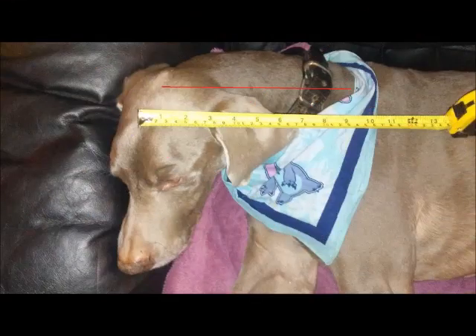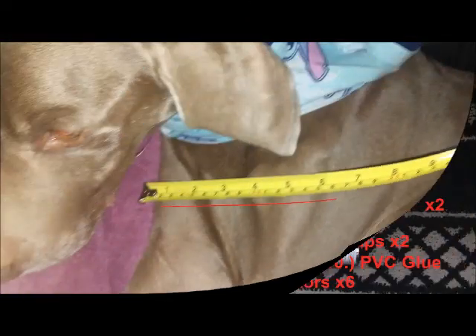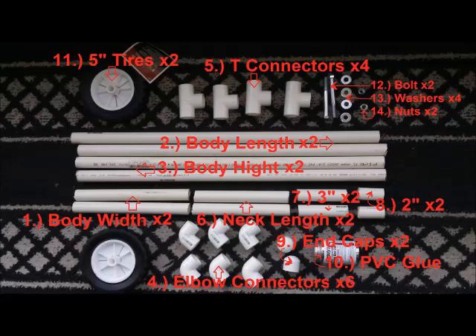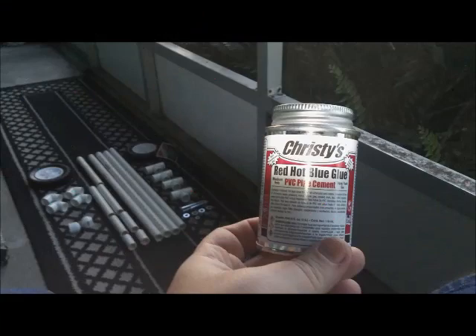You'll also want the complete width of your dog's chest. You'll want to pause on this next image so that you can read all of this information and get acquainted with the different parts. Match up the numbers from the previous image to the numbers on this image to find out exactly where everything goes.